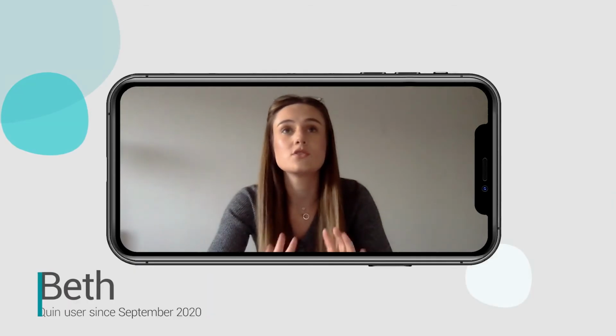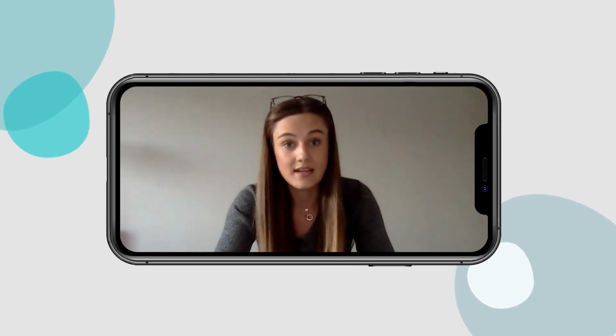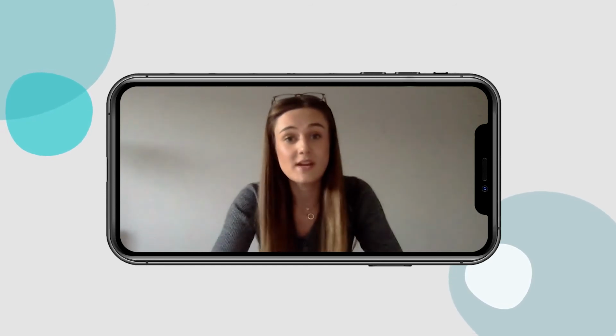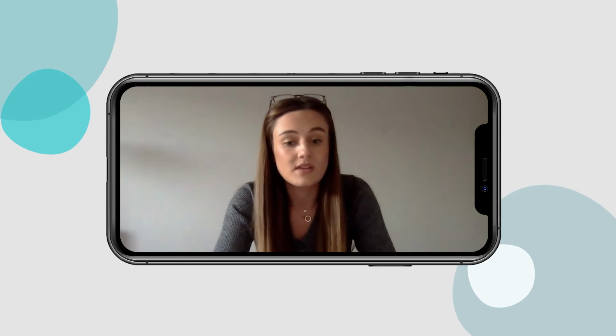This has helped me so much because I'm no longer insulin stacking. So this has resulted in a lot less hypos, which has then stopped me yo-yoing so much. I've not changed anything that I eat, so it's just massively helped. Even if you don't have any of the compatible gadgets, I'd recommend just downloading it and giving it a go to log your insulin. So it's been such a massive help. I don't think I'll ever not use it.